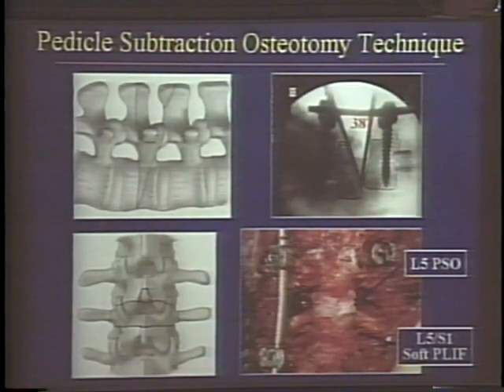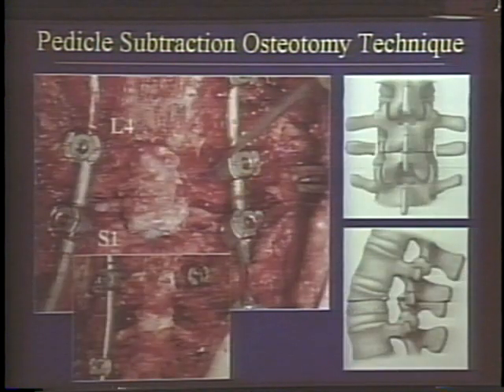So this is our plan, coronal and sagittal. It says intraoperative with the osteotomy has been completed. This is intraoperative. This is the L5 root, the dura, L5 root, and L4 is going to be up there. This is prior to closure, and here the osteotomy has been completed. You see L5, L4, the edges of the dura are not under any compression.